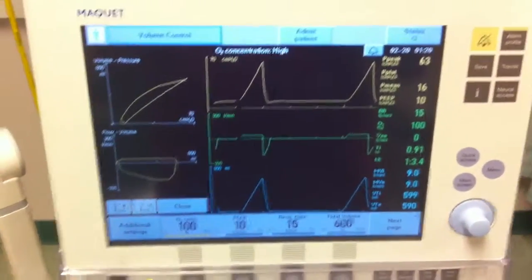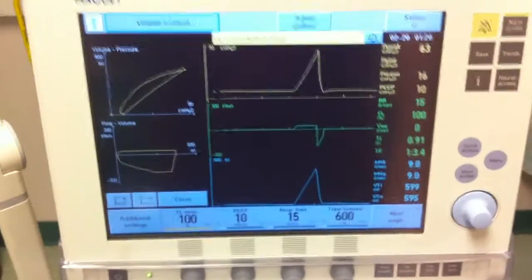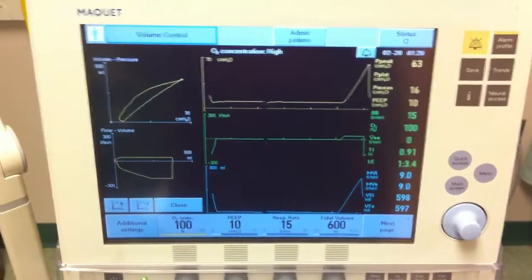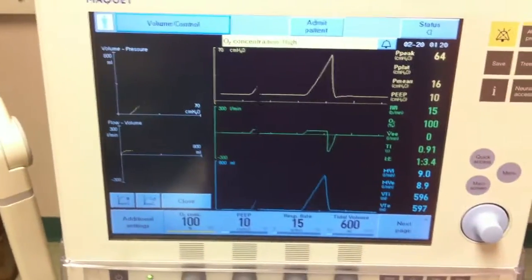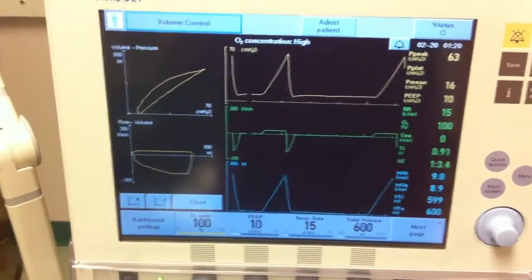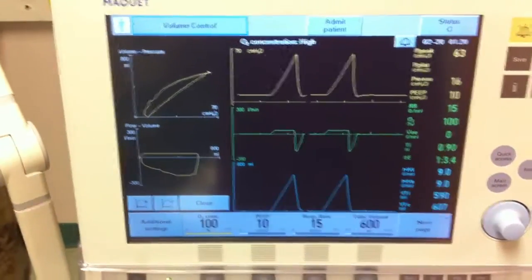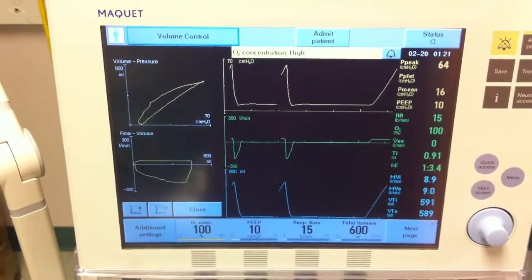Okay, case number 4. Case number 4 is a 42-year-old female who was involved about 5 days ago in a multi-system trauma, ejected from a vehicle that rolled at a high rate of speed. The patient was initially taken to a smaller level 3 trauma facility. At that time, she was intubated and placed on appropriate ventilator settings, and was taken to the operating theater where a hepatic and splenic laceration was repaired, apparently with success.